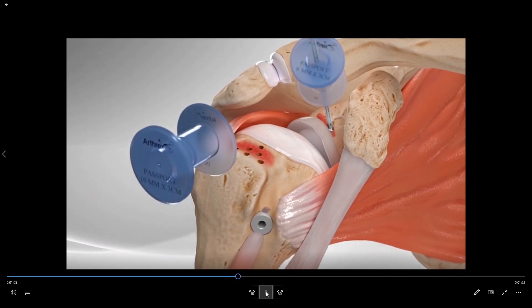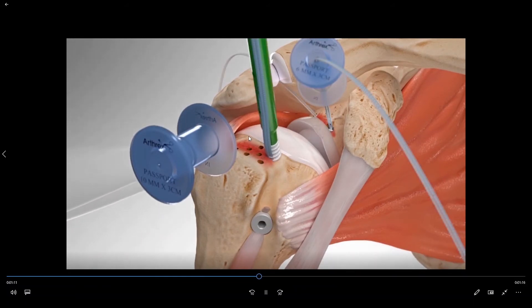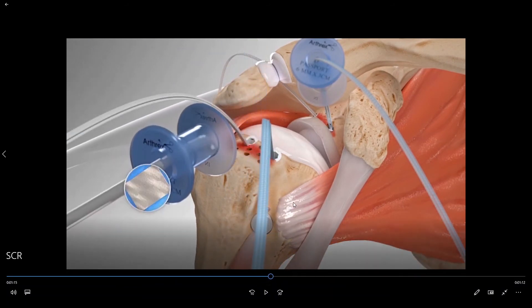We then drill and place anchors into the top of the socket as well as anchors into the top of the ball. Now we have placed anchors into the socket and the ball and driven sutures down into the bone that will then be used to attach the superior capsule reconstruction to the ball and socket.